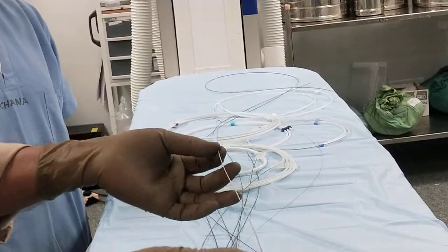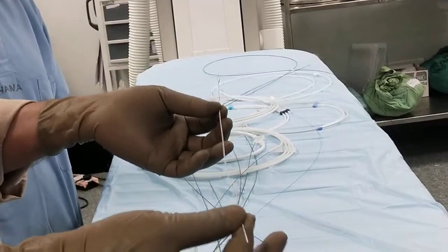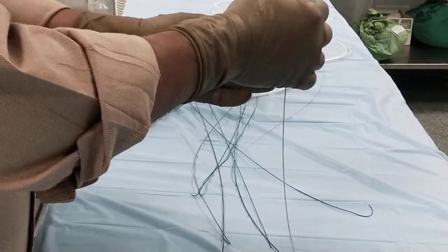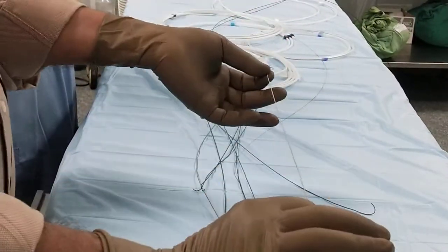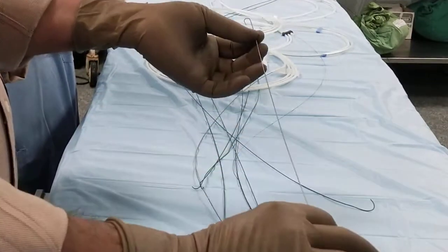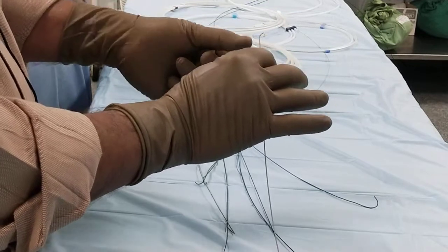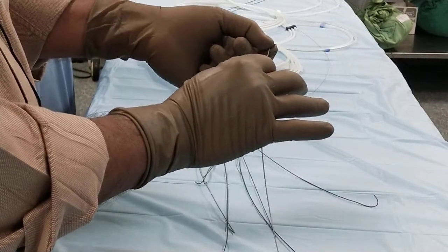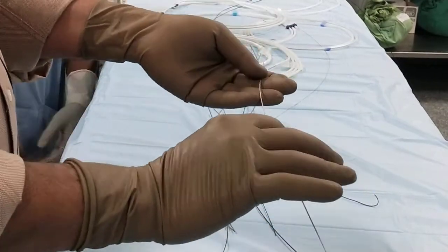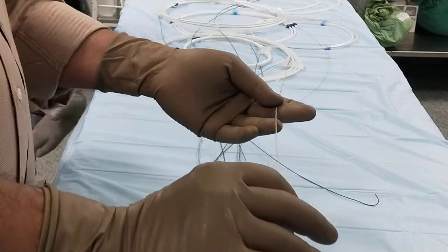This is the initial access guide wire. It sometimes comes with a sheath and sometimes does not. You have to know that whenever you give a needle, the needle should be of such a bore that this guide wire can be introduced through that needle. When they say a 0.038 guide wire, and you are putting a femoral sheath, you have to use this guide wire, so you need a compatible needle.